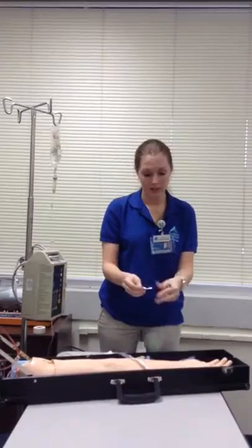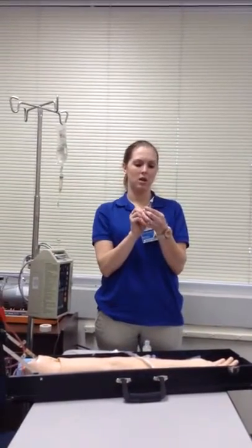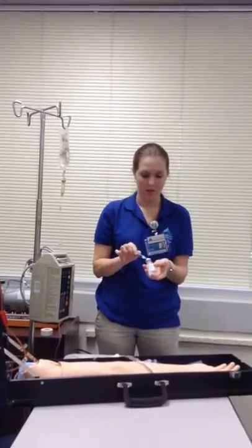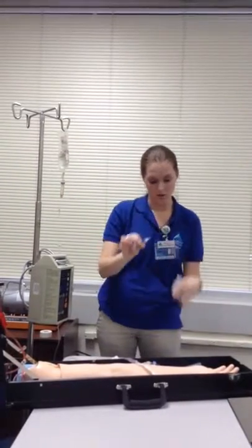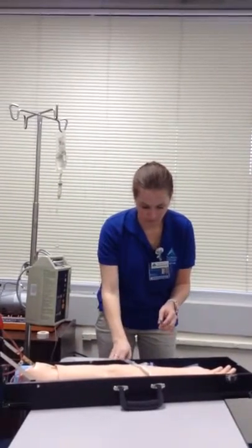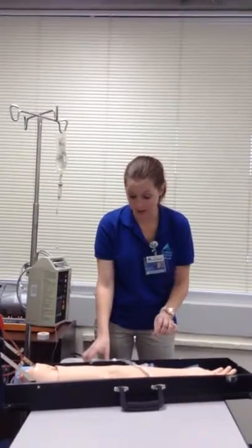I would clean my medication bottle, pull back half a milliliter, push in the air, and pull out half a milliliter of medication. Put that to the side. And that is now ready for me to add to my medication.